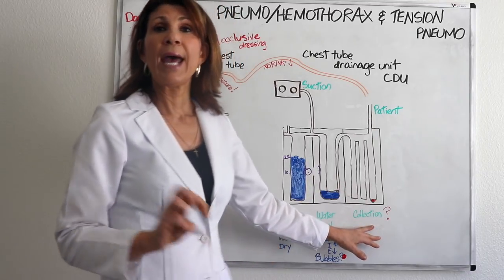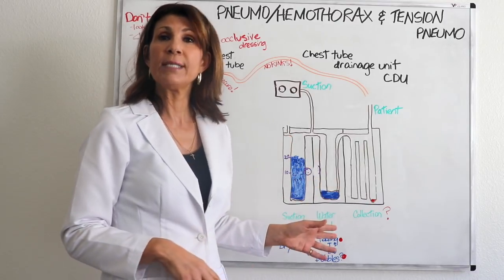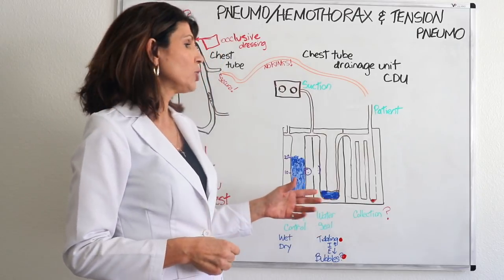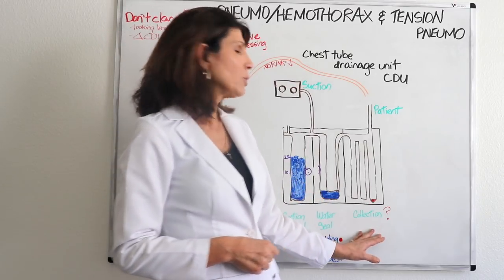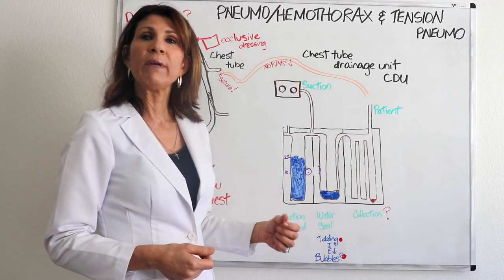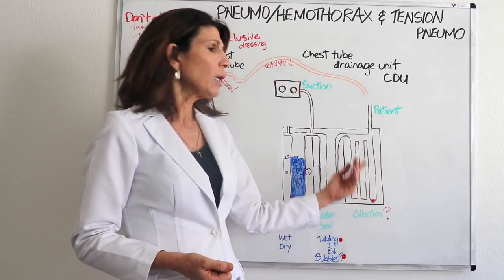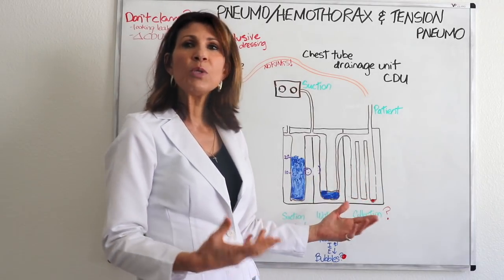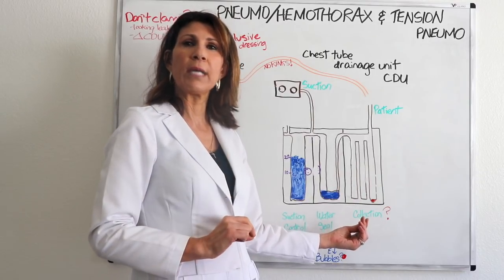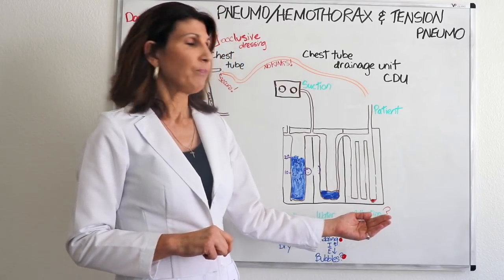The chest tube drainage unit has three chambers, and you need to be very familiar with the reason that your patient has a chest tube in order to know what you're looking at in these chambers. So the first chamber is called the collection chamber. Obviously, if you're resolving a pneumothorax with air coming out of the pleural space, what's going to come through here is not going to be so sensational. You're not going to expect to see anything. Maybe a little bit of serosanguinous from the traumatic insertion, but that's about it.